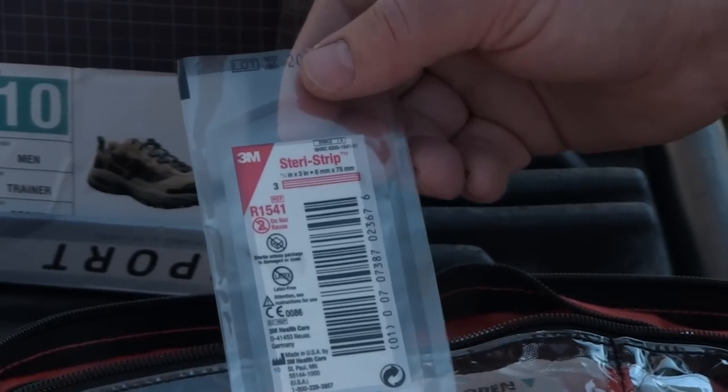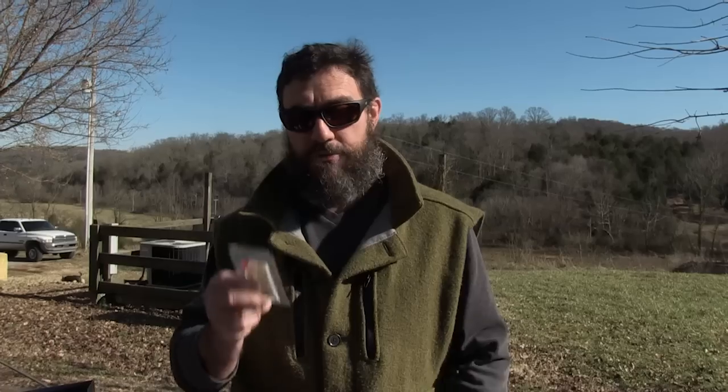Here I have a SteriStrip pack — there are three SteriStrips in it. If a SteriStrip will hold the wound shut and you don't have to use a needle and thread, you'll go for the SteriStrips any day. You can make a lot of friends by breaking out the SteriStrips right after you show your wounded friend the needle and thread.